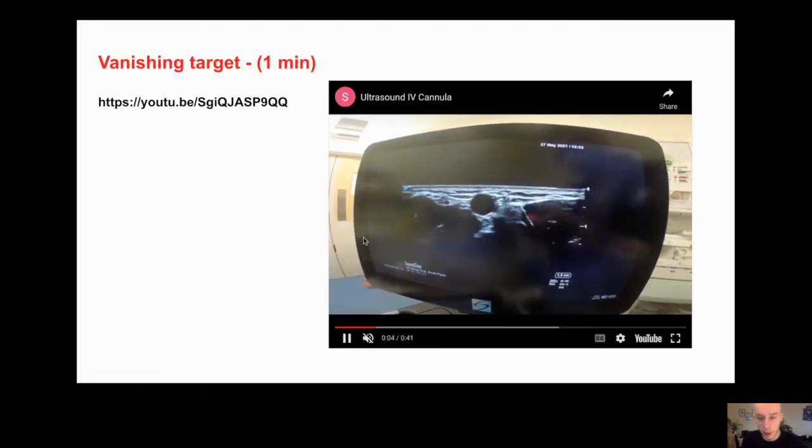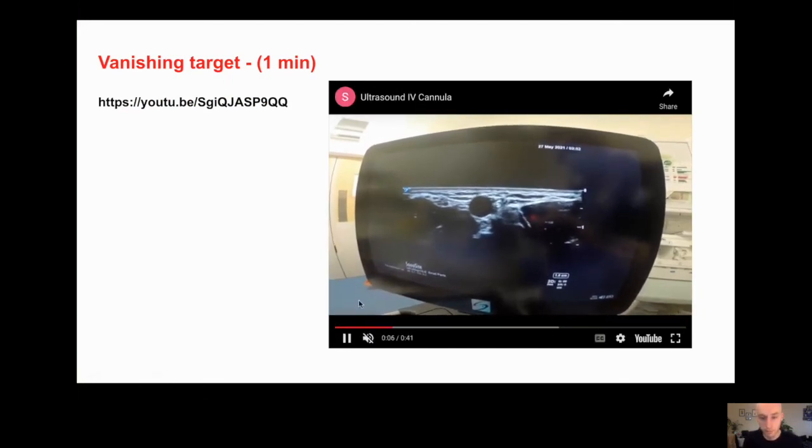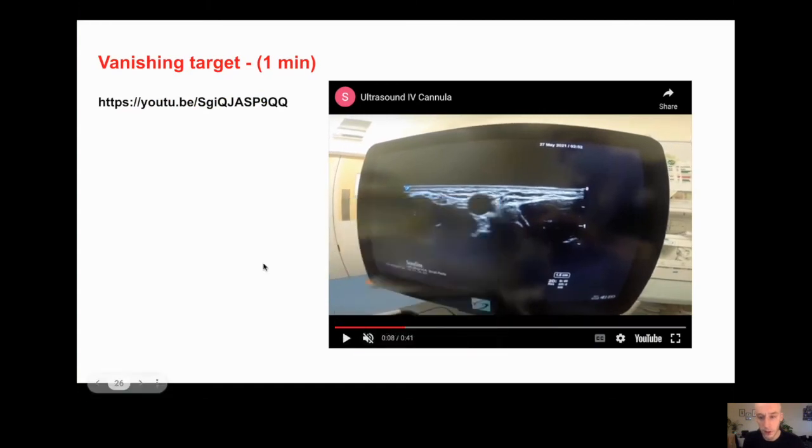I'm going to pause the video and talk through it. So this is my arm. I don't have a very big arm. And so you can see here the depth is 1.5 centimeters. Here are the graduations. So this vessel, this is my basilic vein, is 5 millimeters deep, and it is easily more than 5 millimeters across. So it satisfies our 10-5 rule.